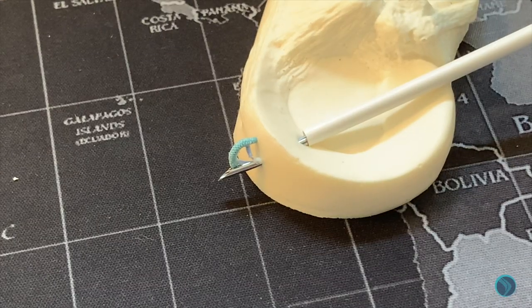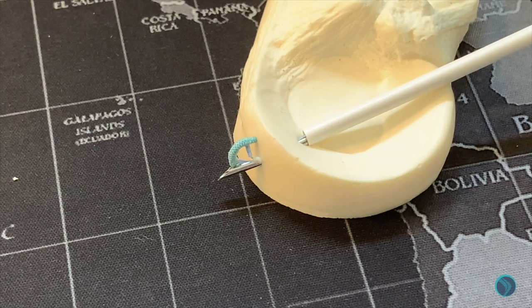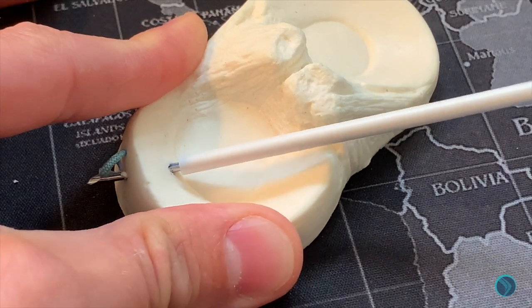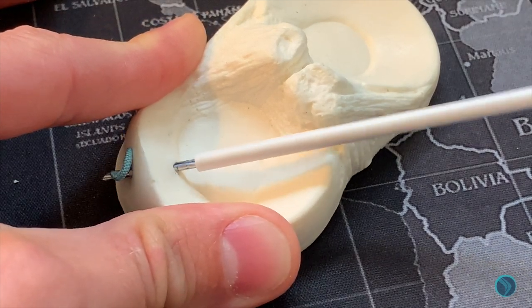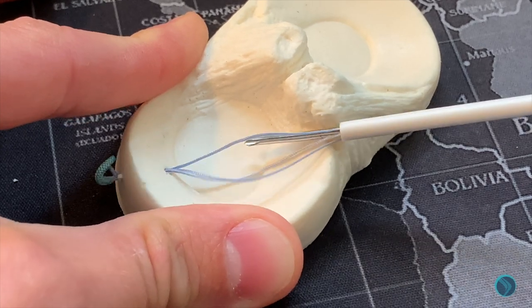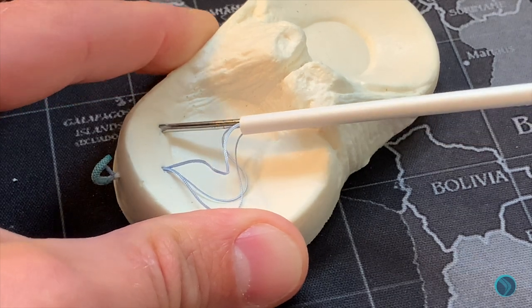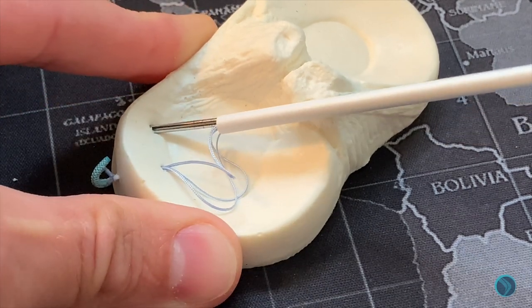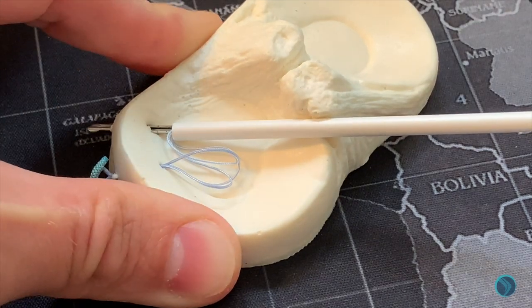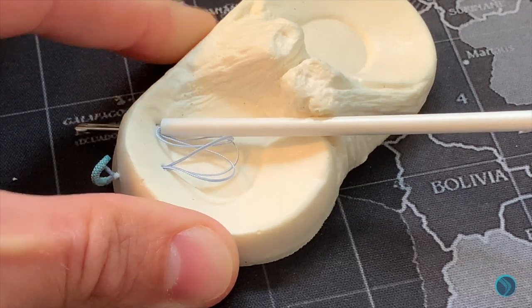Once deployed, you can see the stitch through the posterior aspect. Here's a slightly closer up view of the same thing with the stitch deployed posteriorly. You then bring the needle back through into the joint, leaving the fibre stitch posteriorly, and proceed by repeating the last step — advancing your needle through the posterior capsule again to deploy the second suture.